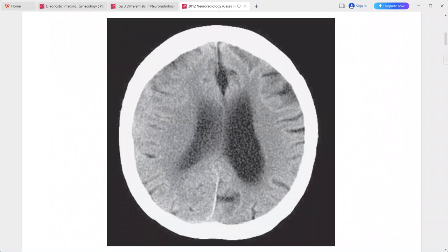Next case: 74-year-old man with frequent falls. The axial CT shows a crescent extra-axial collection along the right cerebral convexity. The collection is isoattenuating to the cerebral gray matter, and the sulci along the right hemisphere do not reach the inner table of the skull.